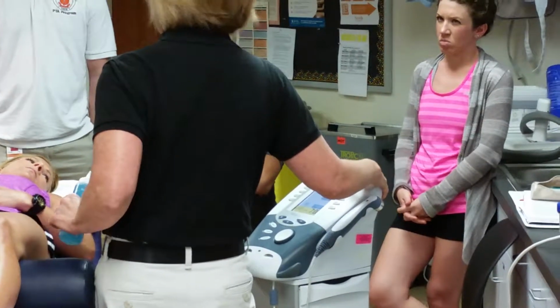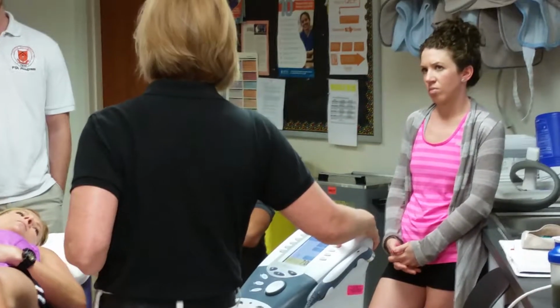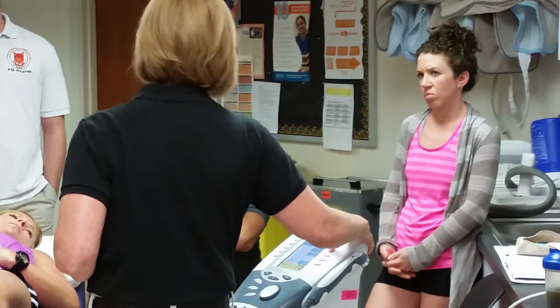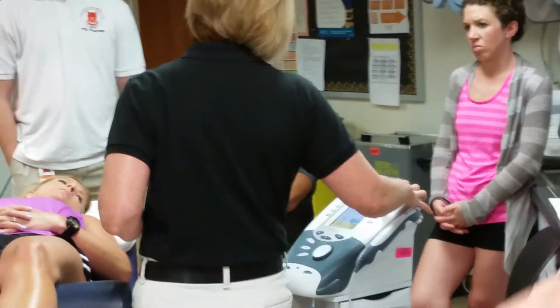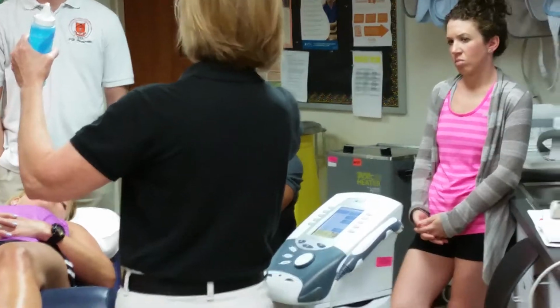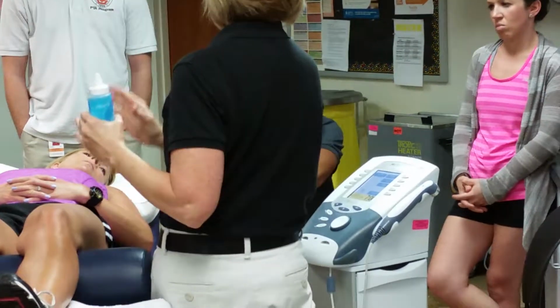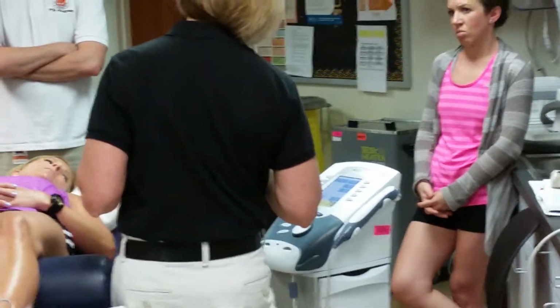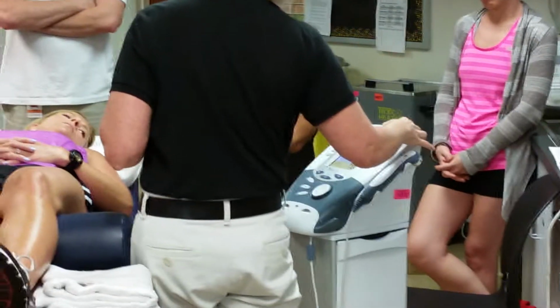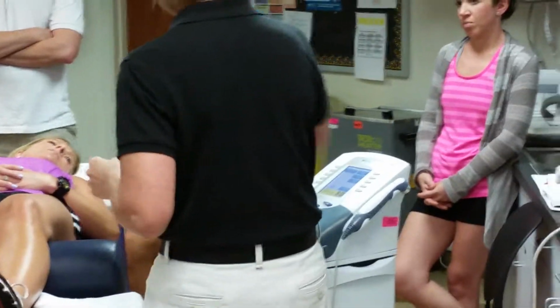Is this superficial or deep? It's superficial. So I'm going to get the higher megahertz. We're going to leave it on 100% duty cycle because I want a thermal effect. I'm going to leave it on watts per centimeter squared. You can actually change it to watts. Watts is just giving you total power, energy being delivered over the area. This is telling me per square area what I'm delivering, which is to me more meaningful. And my head warmer is off. My treatment time, I'm going to increase to 8 minutes. Okay, and now I'm ready to deliver the ultrasound.